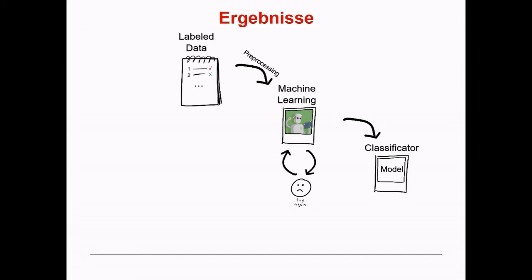And there are tons of algorithms around for natural language processing in English. And German is a particularly confusing language for natural language processing because of the contracted words. And so if you don't have it in German, you have a problem, basically. So this is why you can maybe use existing technology as a first step, but still you would have to put quite some input in it. But I don't want to go into detail too much on that, because the next seminar will be on natural language processing, but I think it's a really important part, as long as I cannot get doctors to input their statements in a structured way.